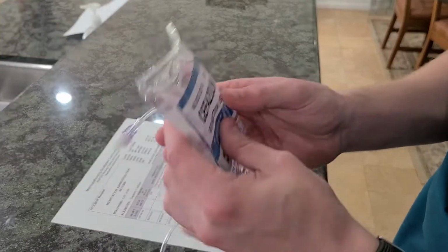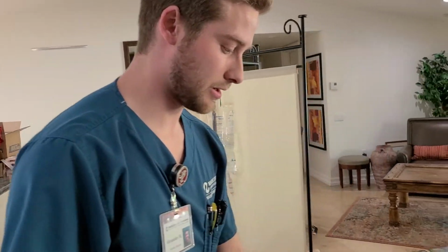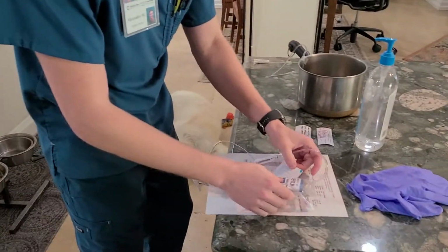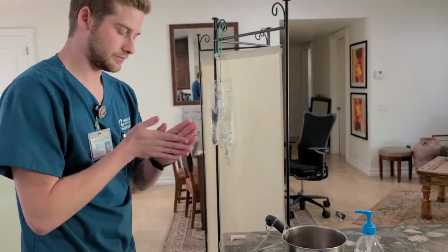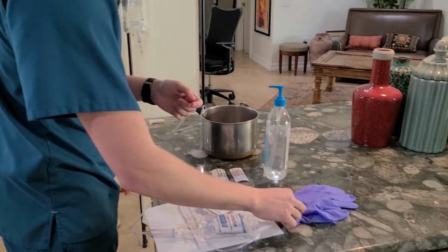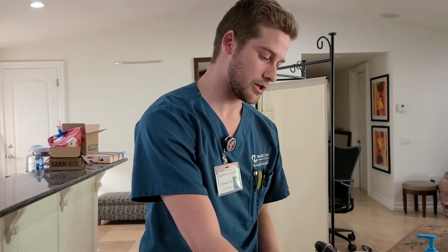So now that I did my last safety check, I'm going to enter the patient's room, or I'm already in the patient's room, so I'm going to have this set up here. I'm going to wash my hands. I'm going to put on my gloves. Oh, before I put on my gloves, I'm going to make sure to educate you on this medication.